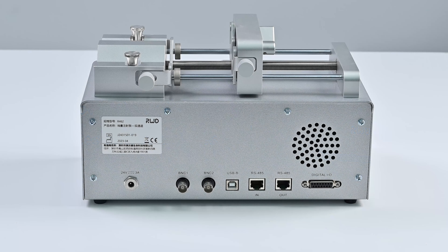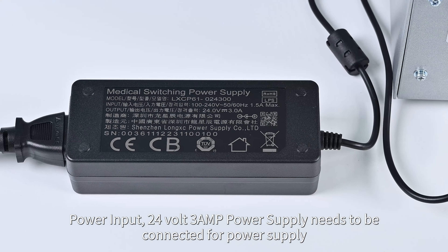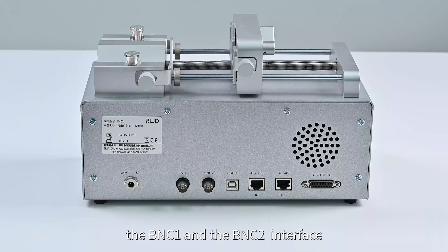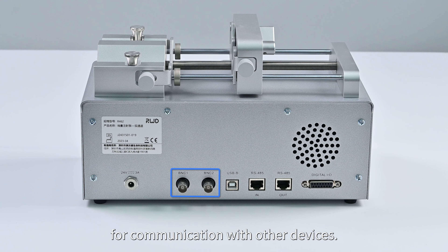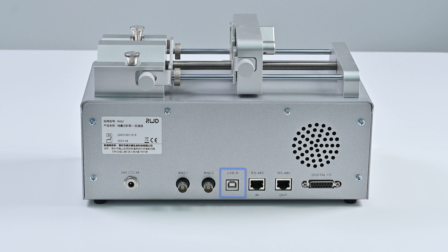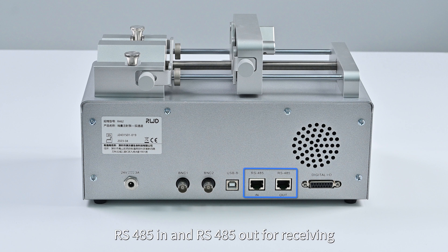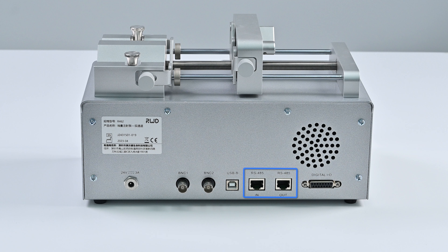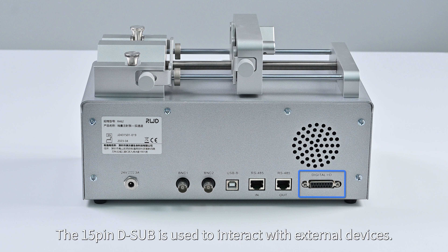Introduction of interfaces and structures. Power input: 24V 3A power supply for power connection. BNC1 and BNC2 interfaces for communication with other devices. USB-B interface pre-reserved for communication with a PC. RS485 in and RS485 out for receiving and sending signals for pump-to-pump communication. The 15-pin D-sub is used to interact with external devices.